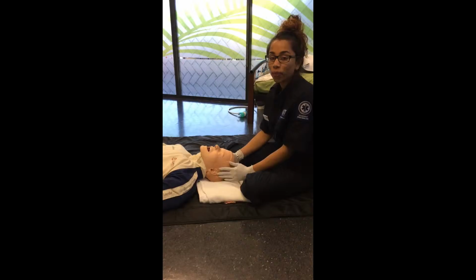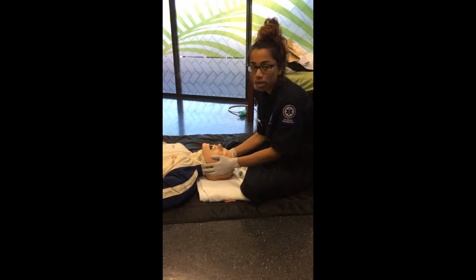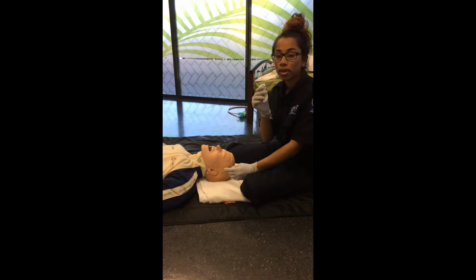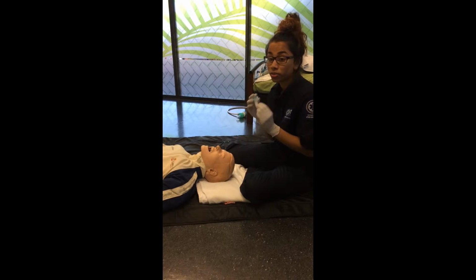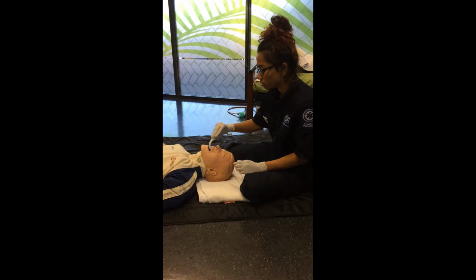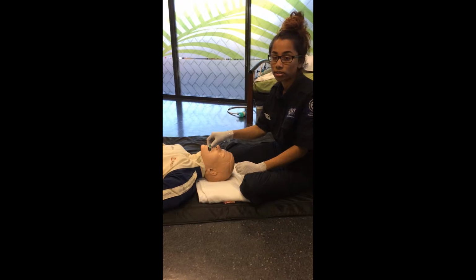Okay. We're going to be doing some airway management, so first you want to tilt the head back to open up the airway. You want to then measure the OPA from the mouth to the mandible, like so. And then when inserting the OPA, you want to insert the curved part towards the mouth, and you want to twist it 180 degrees to avoid catching the tongue.